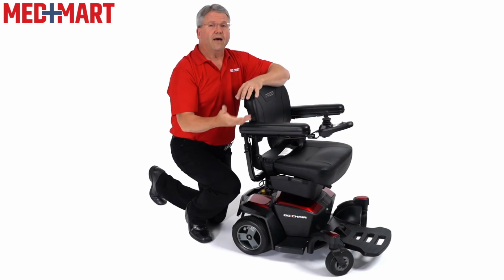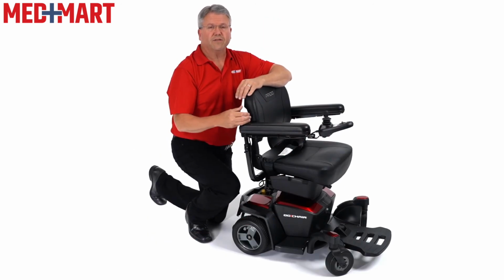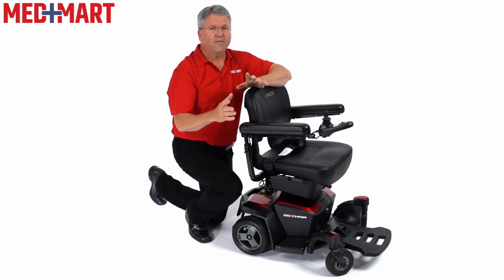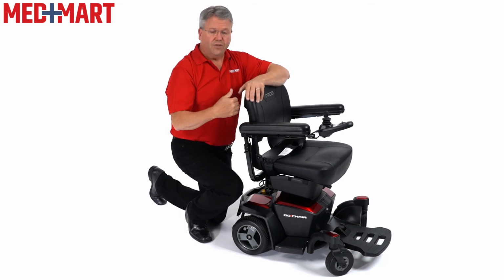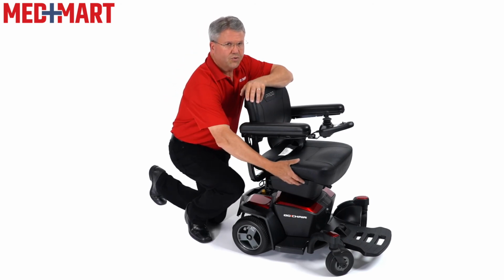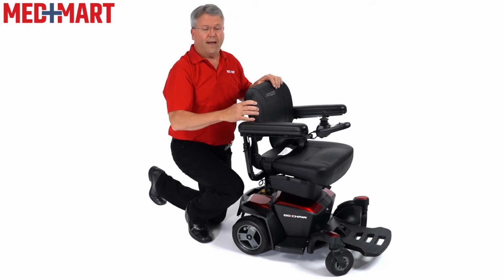We're going to go ahead and show you now how to disassemble the Go Chair. Just remember that the heaviest piece is the rear piece at 36 pounds. If you have any difficulty lifting items like that yourself, obviously you want to make sure you have help. But again, that's the whole point of this chair, to be able to travel and break it down. There are going to be a few steps you have to do. In addition to disconnecting the power, I'm going to show you that you have to have these storage cups out of the way a little bit in order to get the seat off. So we'll go ahead and show you all that right now.